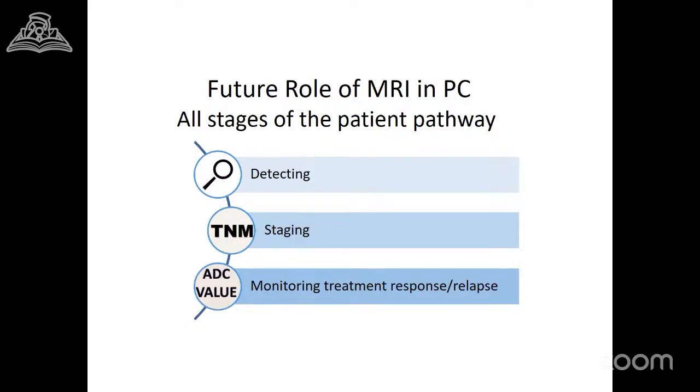In addition, MRI is increasingly valuable in monitoring treatment response and detecting relapse or recurrence after therapy, making it an important tool in both diagnosis and long-term patient management.